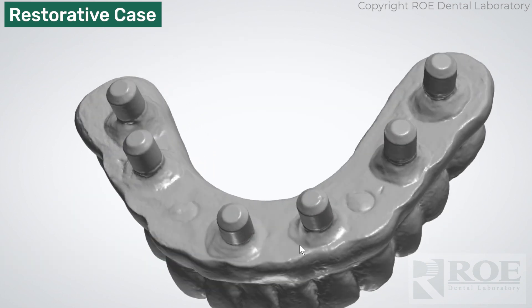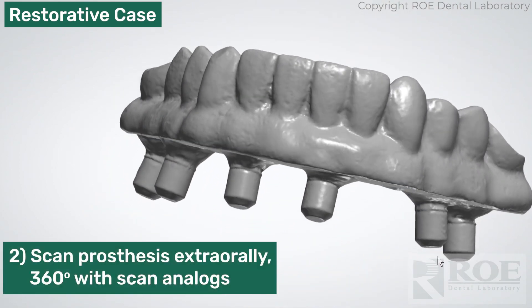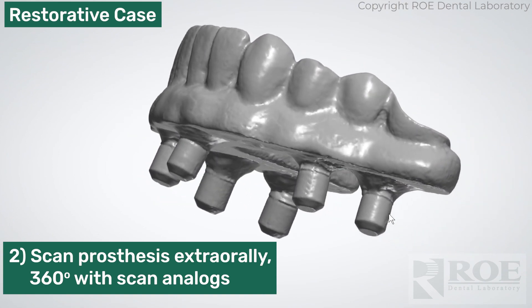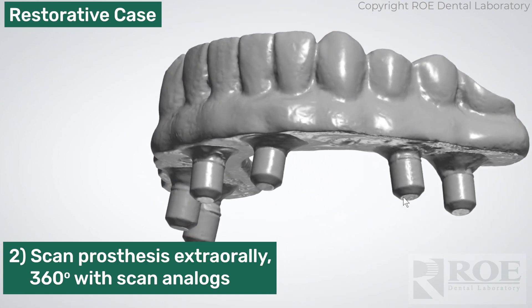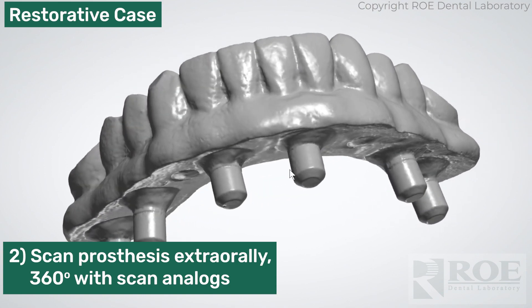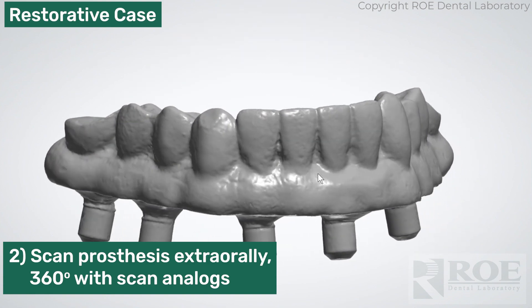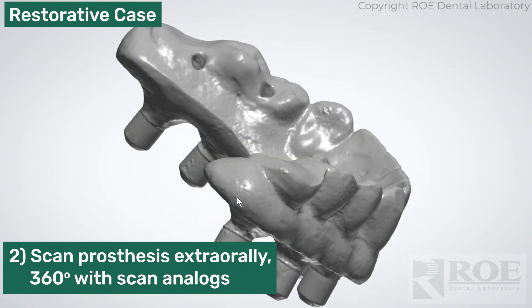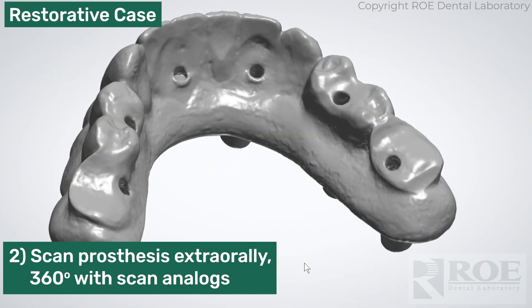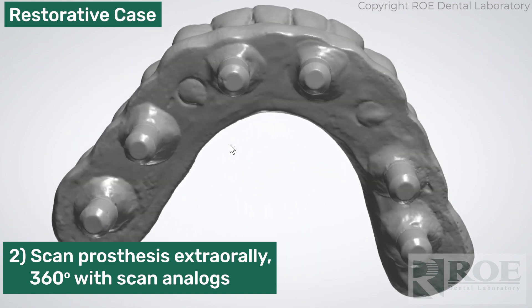Then the prosthesis is removed and it is scanned extra-orally with the OptiSplint scan analogs plugged into the copings — the Nobel-compatible copings. You'll notice that there is no wash impression. We are not going to use the intaglio of the prosthesis to design the prosthesis. Nice 360 scan, a lot of detail — take a lot of time with this scan. We want to get the teeth perfectly and we want to get the scan bodies.